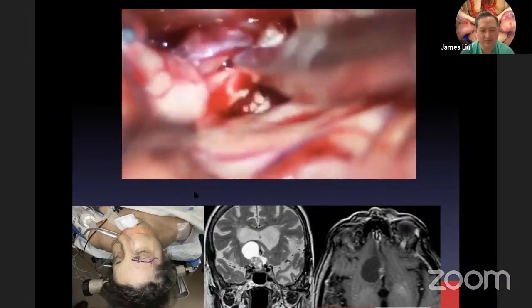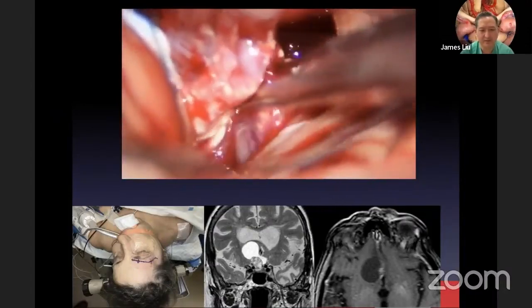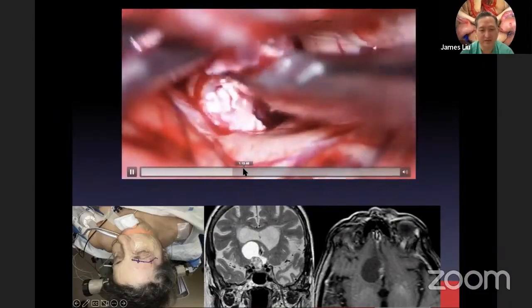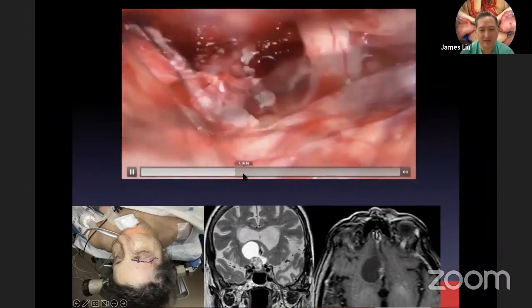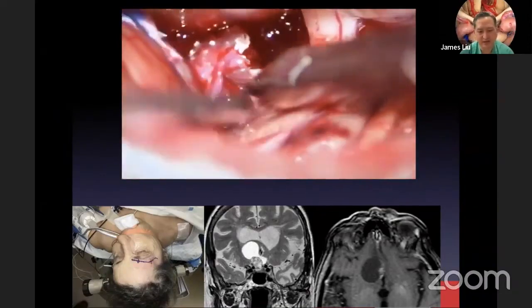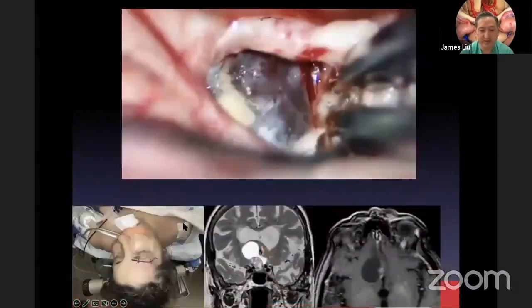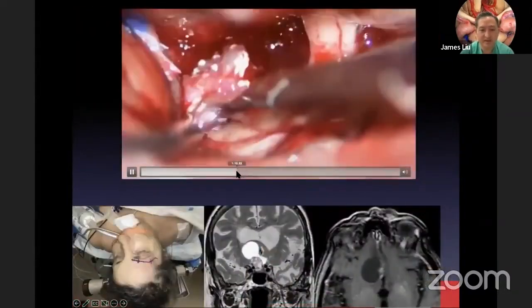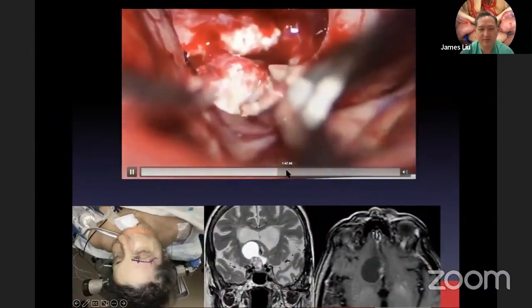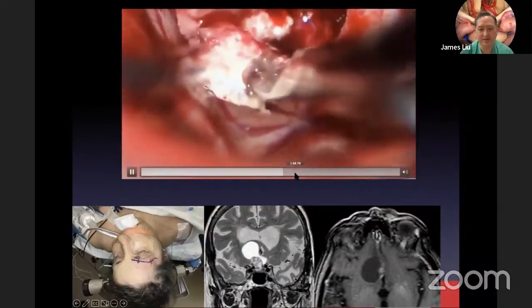These redo surgeries can be quite challenging, but you need to do sharp dissection when you're dealing with scar tissue. Blunt dissection will result in complications of avulsing neurovascular structures. So we piecemeal dissect in a sharp dissection fashion. And with piecemeal removal, we can dissect away this tumor.